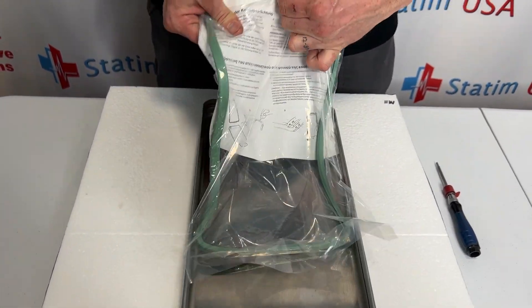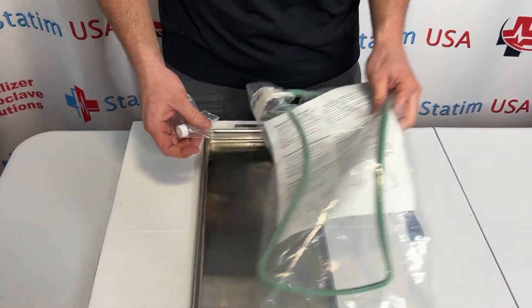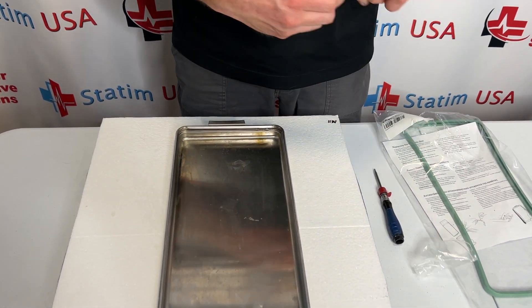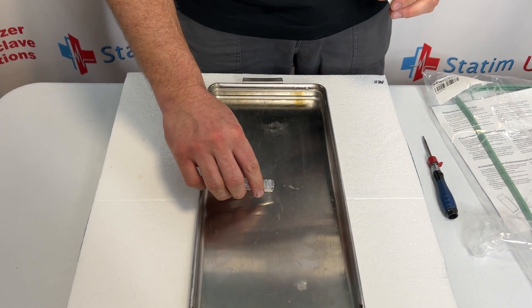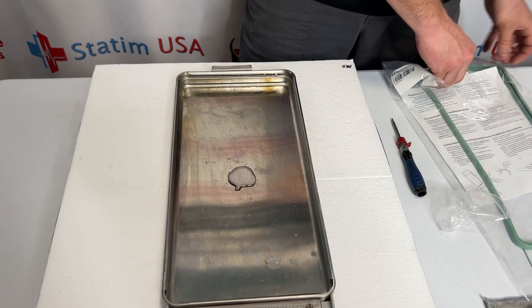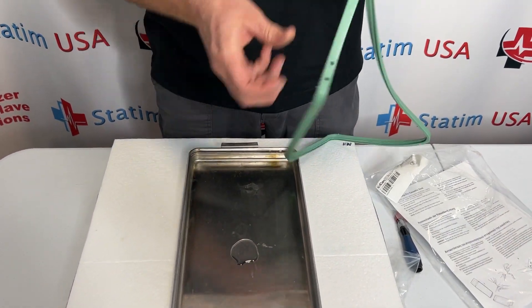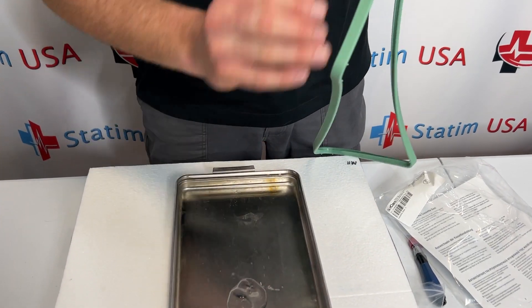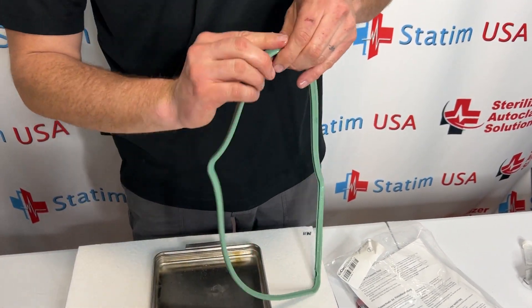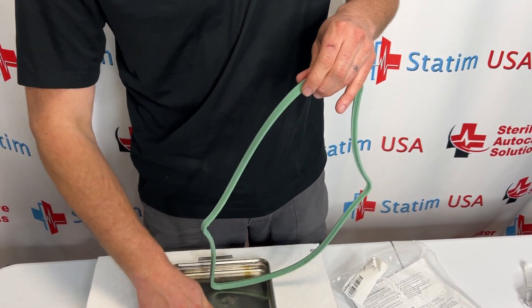With our new cassette seal, we're going to take the provided lubricant. I'm going to use about half this vial and pour it right there in the center. Set that off to the side. Take a couple of fingers and we're just going to lubricate this entire seal, going all the way around. This will help slide this into place.